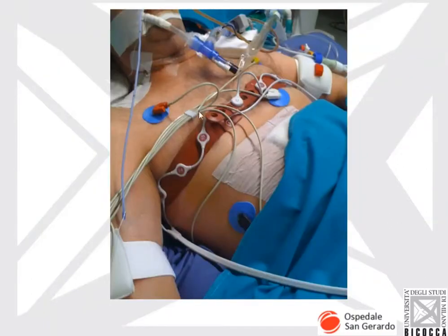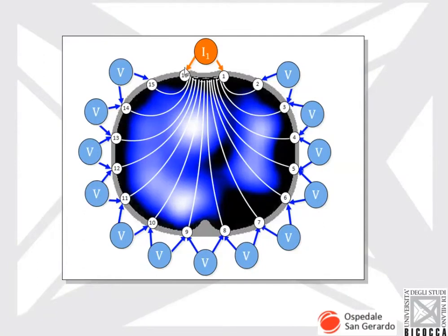So this is the belt surrounding the chest of the patient with all the electrodes attached. And basically, the machine injects the current through a couple of electrodes and reads the difference of potential among all the other couples.